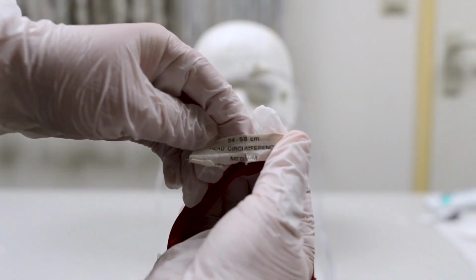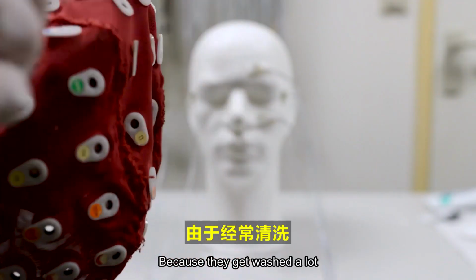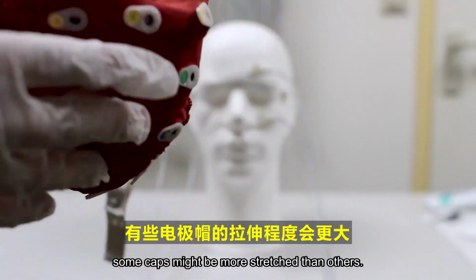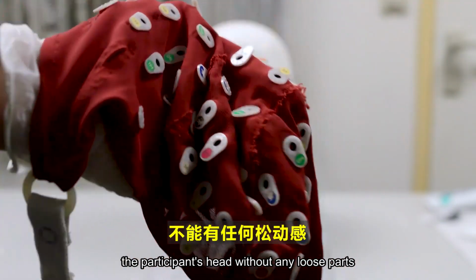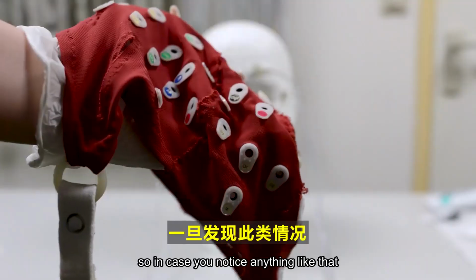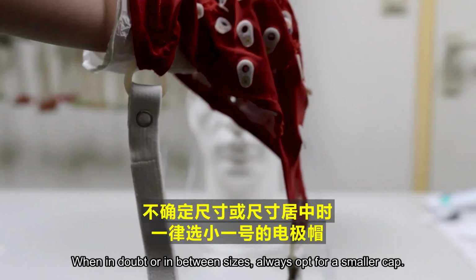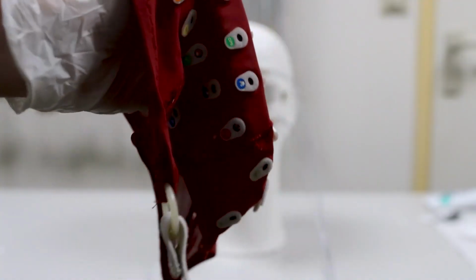Because they get washed a lot, and may be a little old, some caps might be more stretched than others. The cap should always fit snug around the participant's head without any loose parts, so in case you notice anything like that, you should change the cap for a better fitting cap. When in doubt, or in between sizes, always opt for a smaller cap.